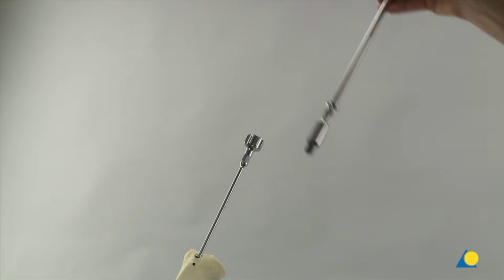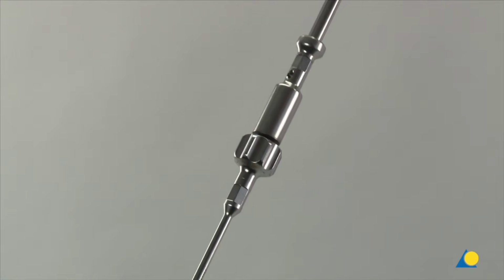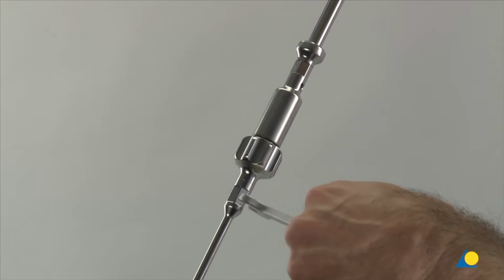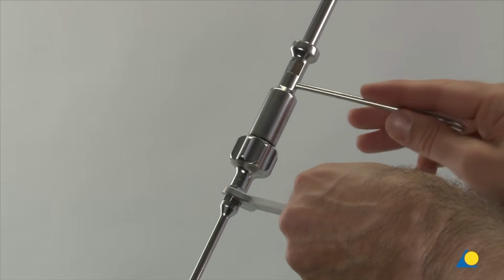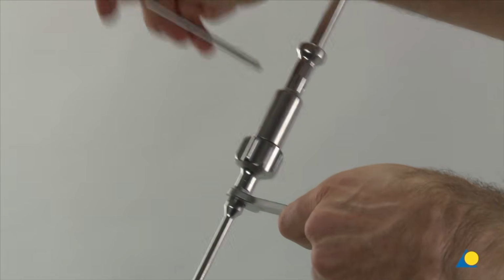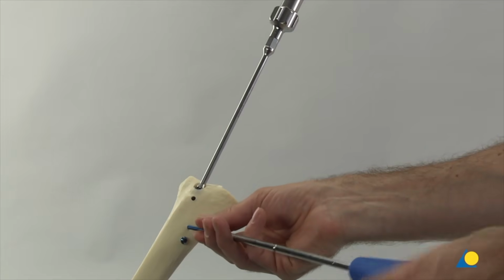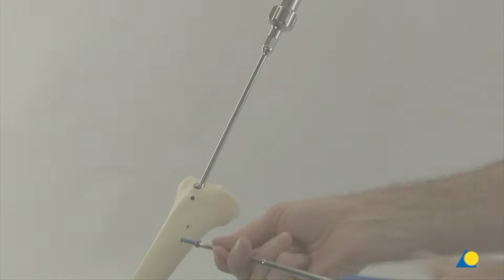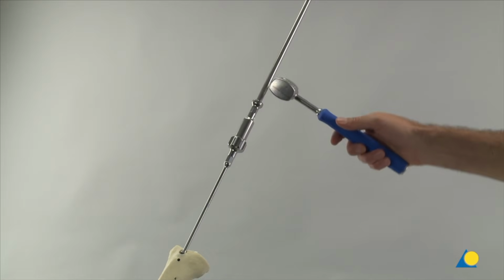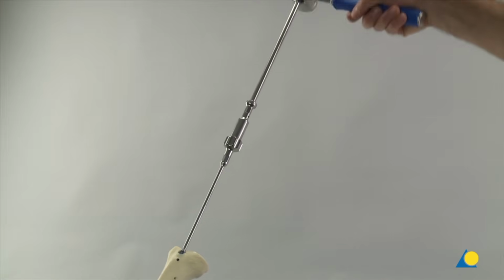The hammer guide is attached to the extraction screw and tightened with the pin wrench. The T25 star drive screwdriver is used to remove the locking screws. The combined hammer is attached to the hammer guide, and the nail is extracted with gentle blows using the backslap technique.